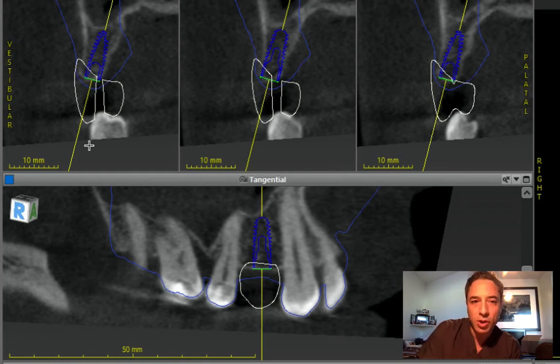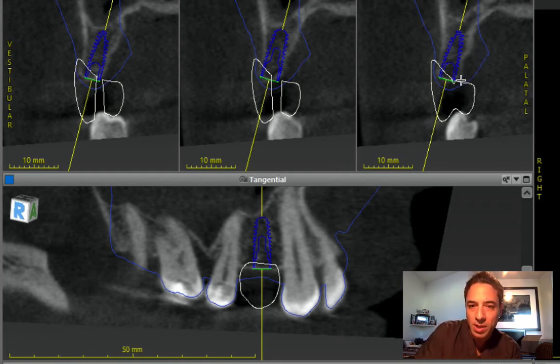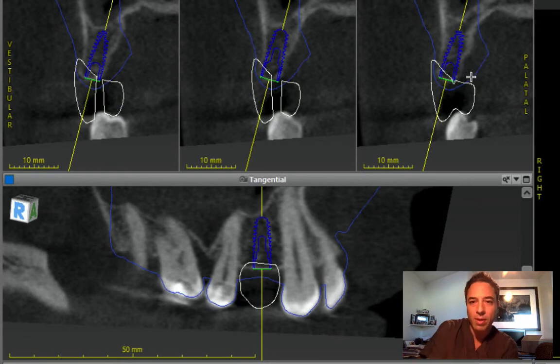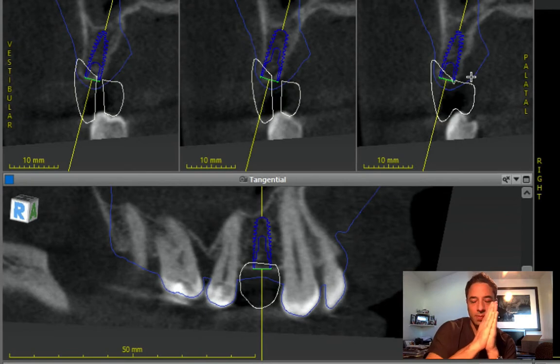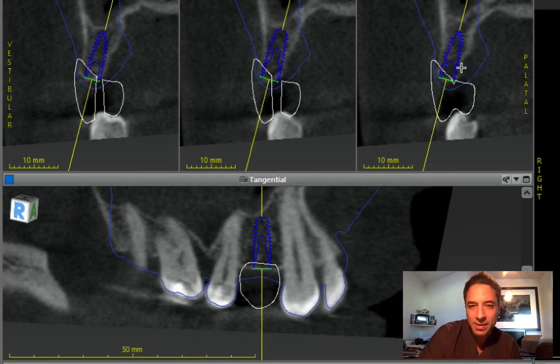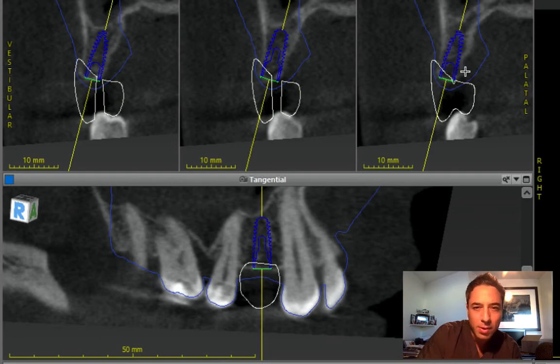The deficiency, if you're looking here, is more on the palatal. There's almost like a little segment missing. So ideally, I would have loved to see this implant rotated a little more to the palate. But you can do it only so much without blowing out the palatal plate.